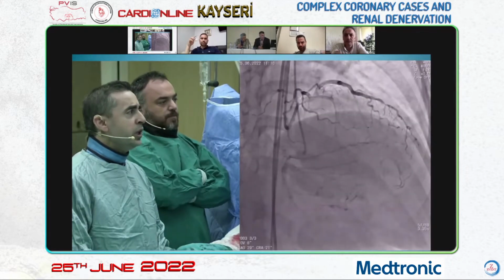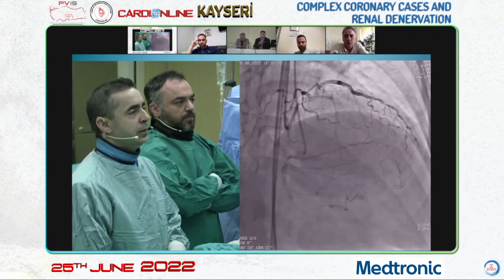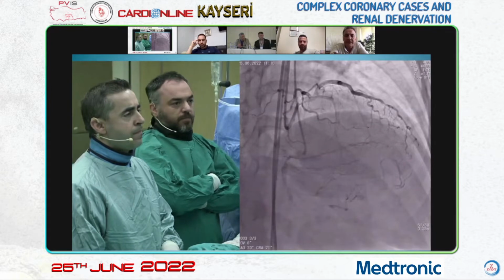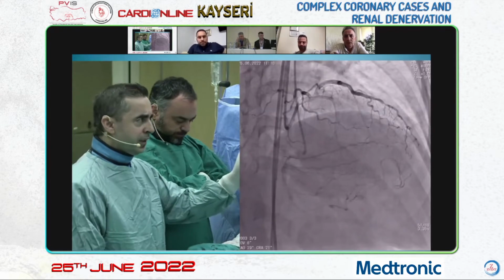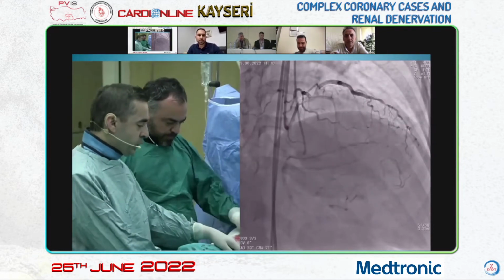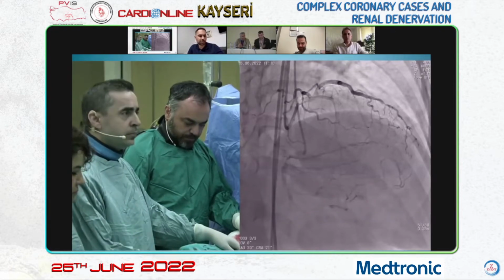Can we see the recent views? It is filled until the curve. It's not that long then, because it seems to be long. However, the possibility is less. Here we see the filling actually. We will start with the Pilot, then we place the microcatheter and we will continue. Yes, we can continue the discussion while you do the action.